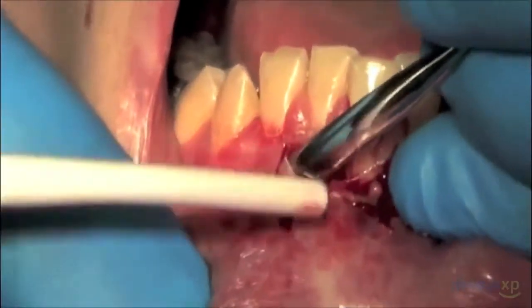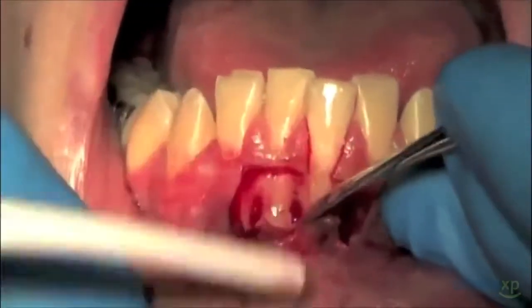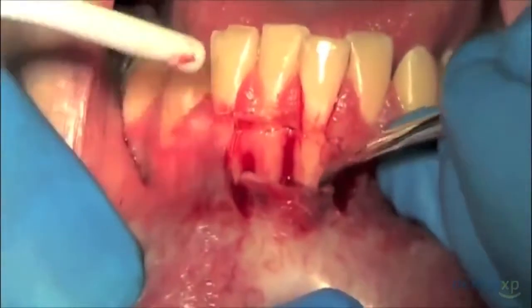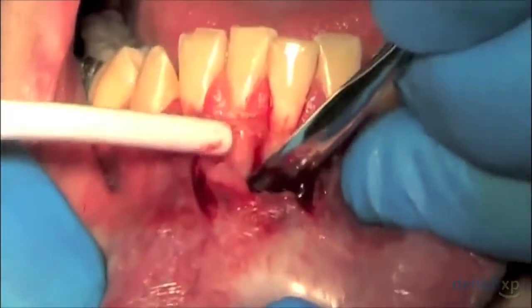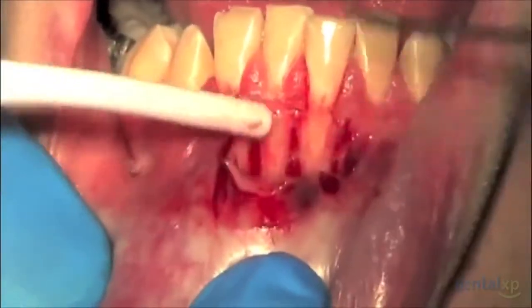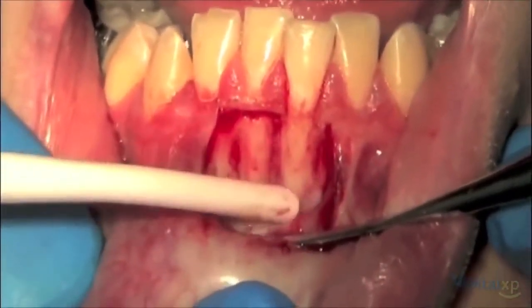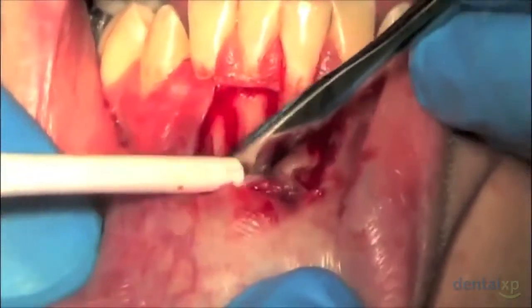As I'm doing this, you can see that we're taking this full thickness all the way to the bone, fully exposing the root surfaces. And in this situation, at least for number 24, you can see that a large underlying dehiscence is present. This flap has continued to be reflected past the apical extent of the dehiscence so that the full extent of the defect can be visualized.